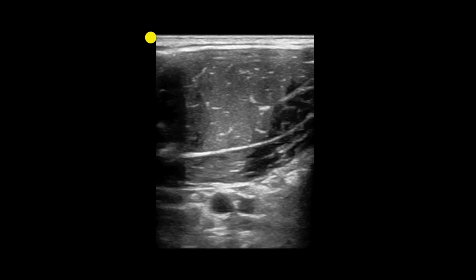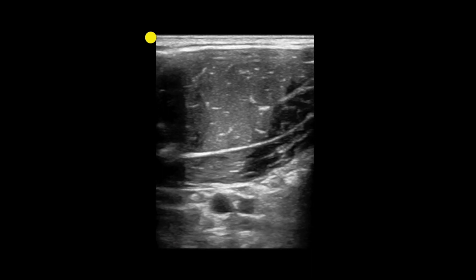Both vessels might be pulsatile, making it difficult to tell what's what. We'll rely on pulse wave Doppler to tell us the difference between the artery and the vein. With pulse wave Doppler, you put the sample volume over each vessel and run your Doppler waves. An arterial waveform will give you a spike, whereas venous flow gives you a more continuous, low-velocity flow. My sound effects are pretty terrible.